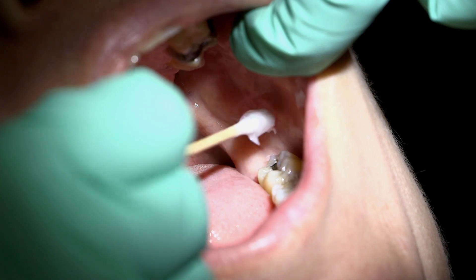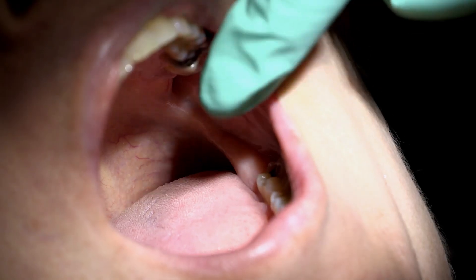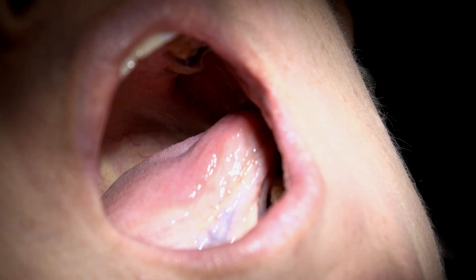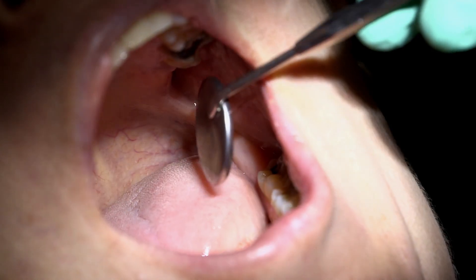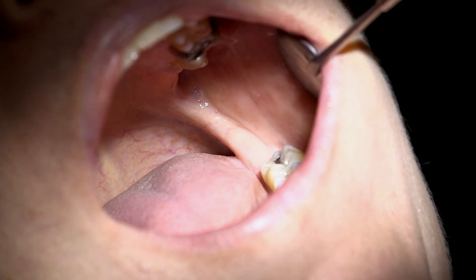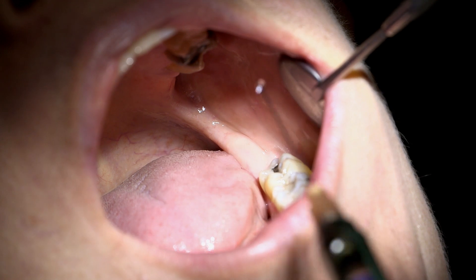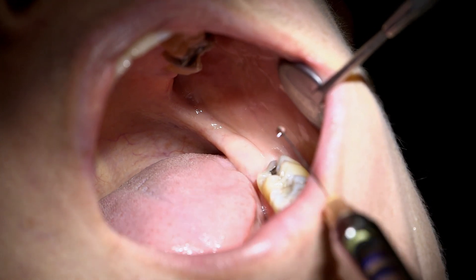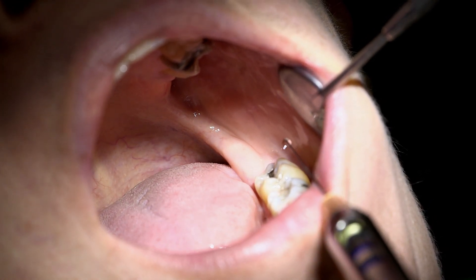The needle length for the long buccal block may be long or short, but usually this injection is used in conjunction with an inferior alveolar nerve block, in which case you would use the same long needle. Carefully retract the buccal mucosa with the mirror and hold the tissue taut.